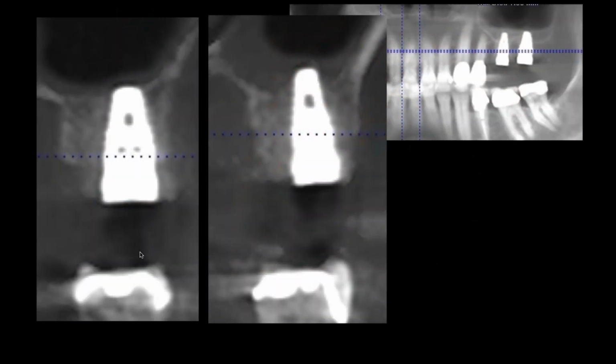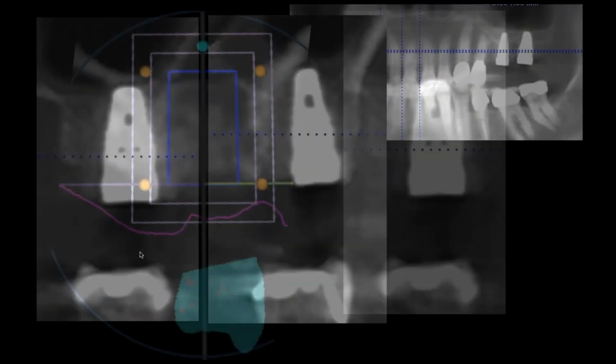And then we put the implants in, but you can see I can take the lower teeth out. I can look at it a variety of different ways. And this is very easy for me. I find that this is an easy way for me to be able to deliver very accurate care for the patient. And then subsequently, when the implants are in, you can see they're lined straight up and down.